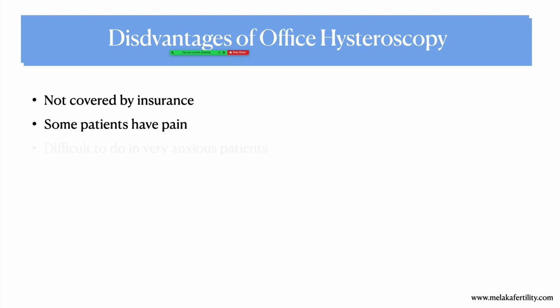Some patients will have pain, and it is difficult to do in very anxious patients. I always talk to the patient. I said, you will have a little bit of discomfort, pain. If there's pain, I'll stop. Is it okay? If they say it's okay, then we'll proceed and do the office hysteroscopy.